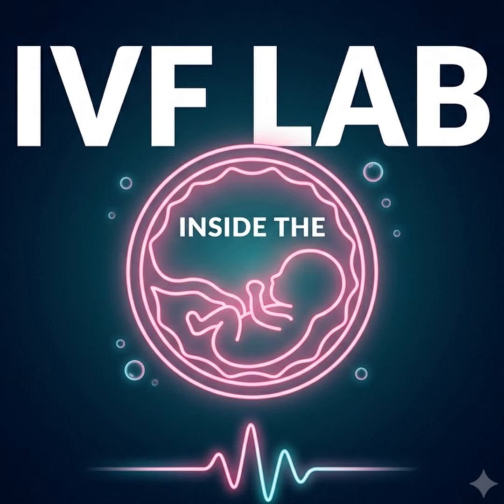So how does the technology solve that? By completely changing the type of light used. Time-lapse systems do not use white, full-spectrum light. They use very specific wavelengths of red or near-infrared light. Oh, interesting. Yeah, these longer wavelengths carry significantly less energy and do not penetrate and damage the cellular structures the way shorter wavelengths do. Furthermore, the light isn't left on.